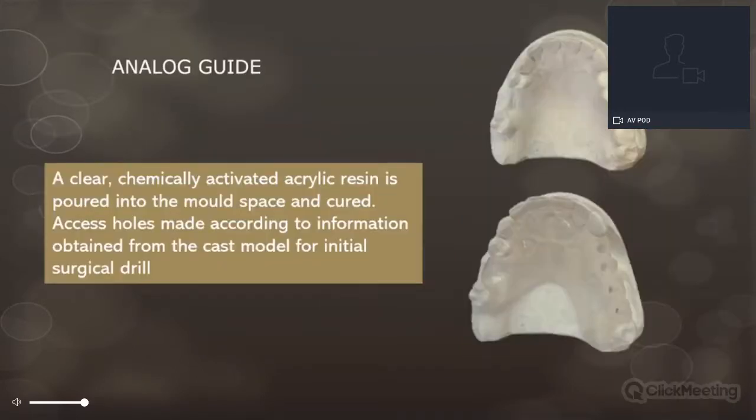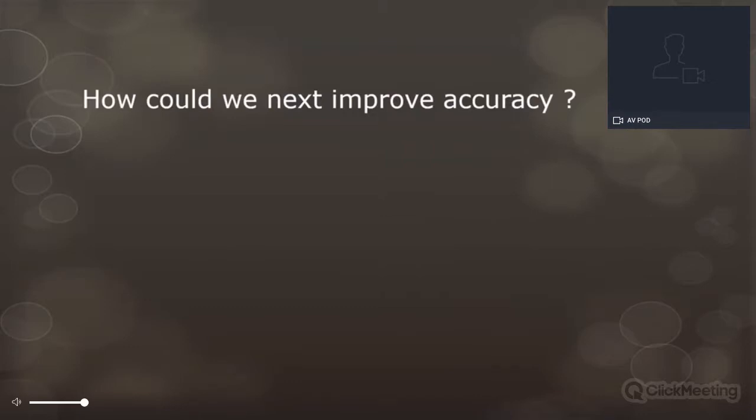However, even with the analog workflow, a surgical guide is necessary to help us guide the implants to the correct prosthetic envelope for the technician to give us a desired outcome. How could we next improve accuracy following on from the traditional acrylic surgical guide?